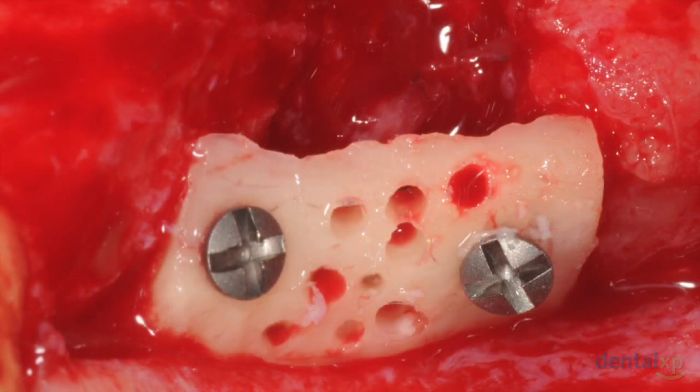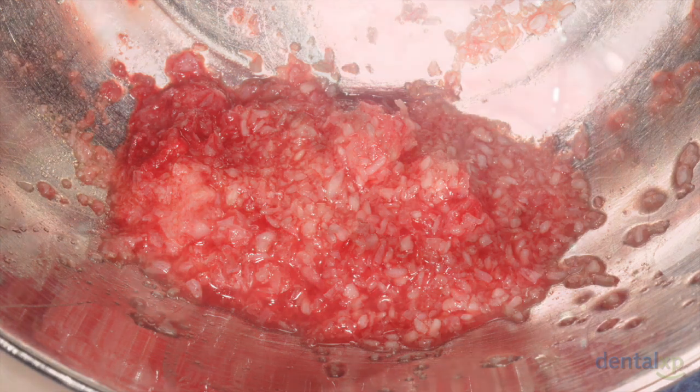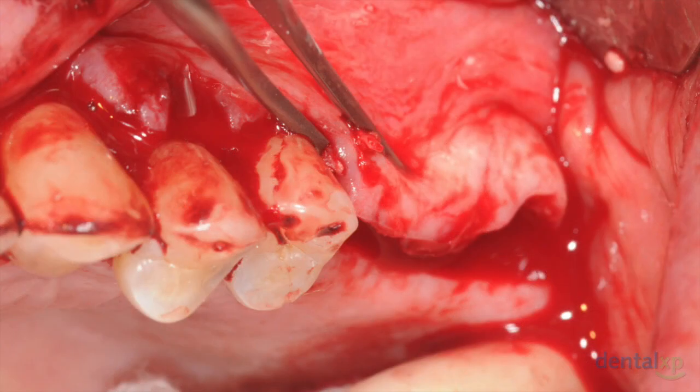We'll also place several perforations in the cortical shell for increased vascularization. For the sinus lift and the interpositional gap, we'll create a particulate complex using a mixture of autogenous particulate bone from the ramus and mineralized freeze-dried bone. Prior to the particulate grafting, we'll mobilize the flap using periosteal scoring to assure a passive and tensionless closure.